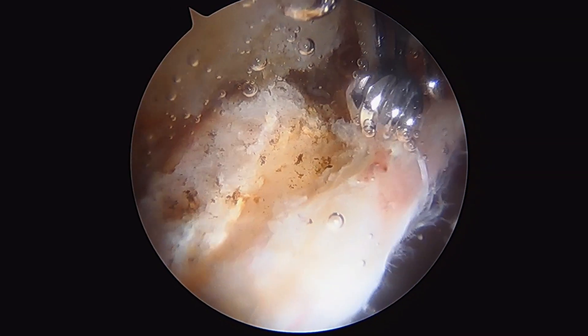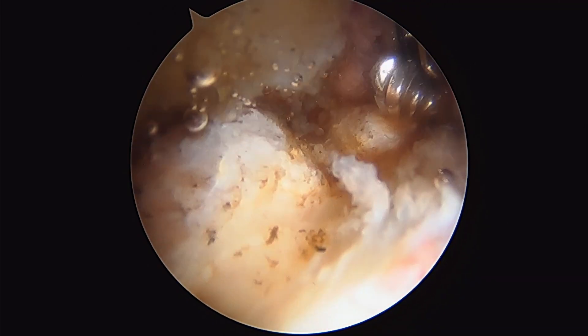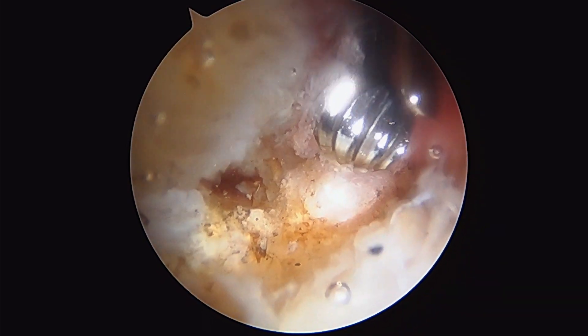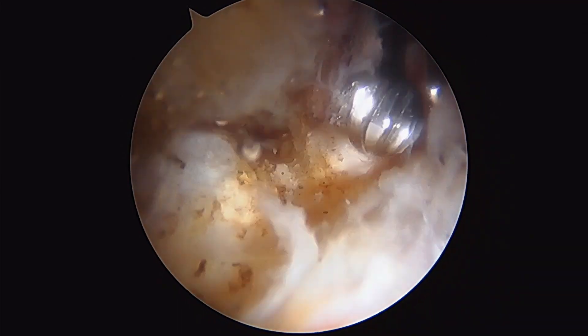Our first step here is called an acetabularplasty. There's a bone spur right here and here along the acetabulum. This is called a pincer lesion in the setting of femoral acetabular impingement. I'm going to show you how we take this away.